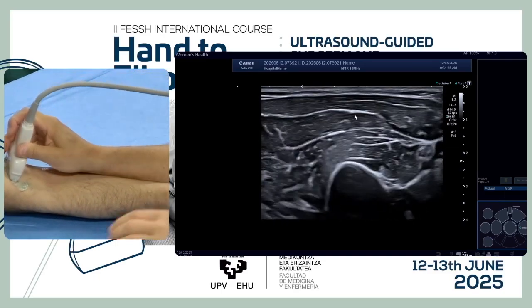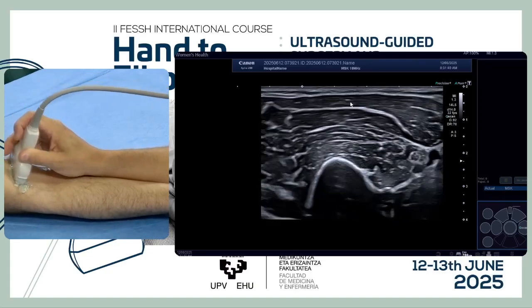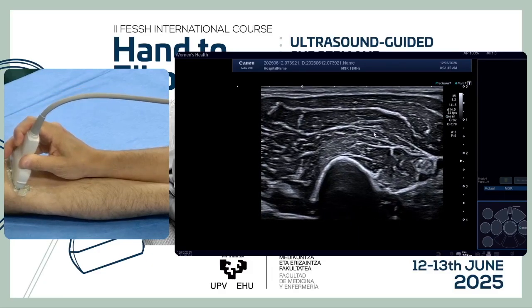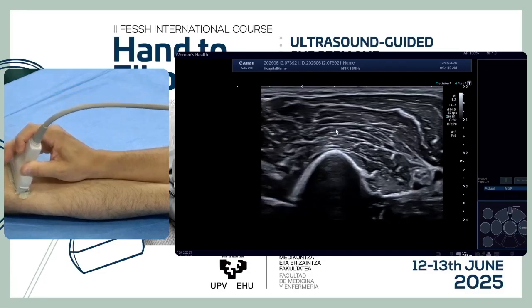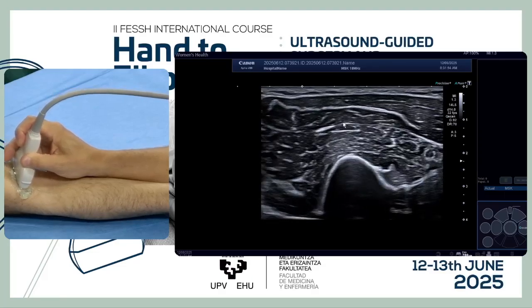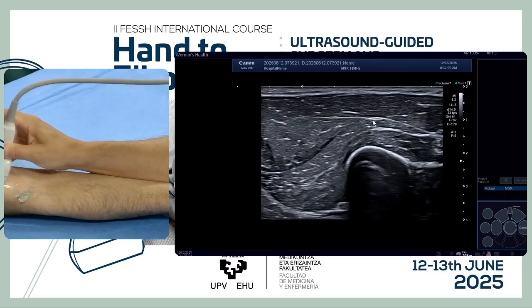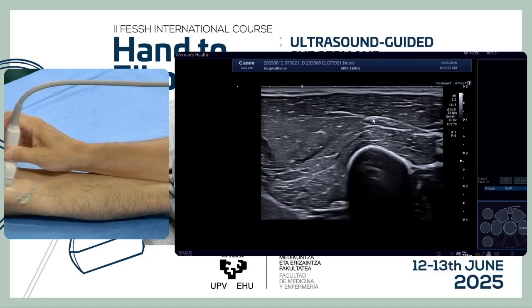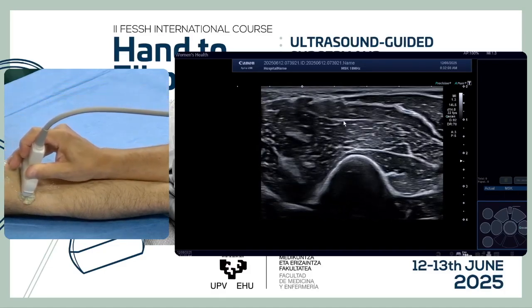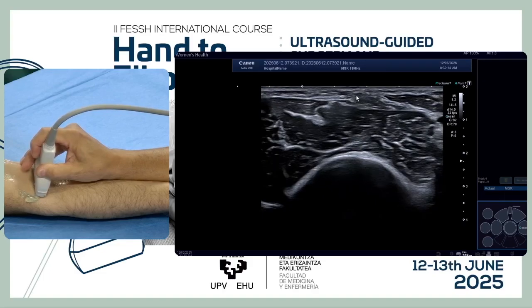If we go to the arm, we can see the two big bellies — the belly of the biceps and the belly of the brachialis. The intermuscular space is not very clear; we have to move both bellies just to check the space between them. In the middle of the belly, we can find the musculocutaneous nerve going down, and we see how it moves distal until it goes just lateral to join the biceps tendon.